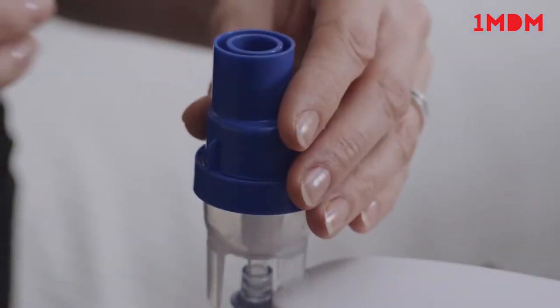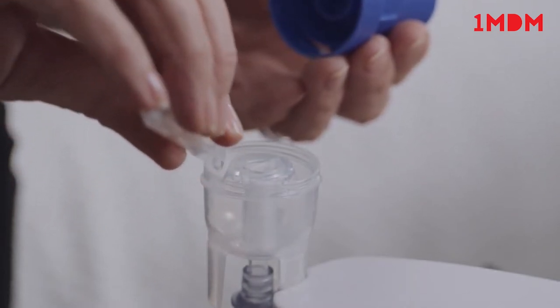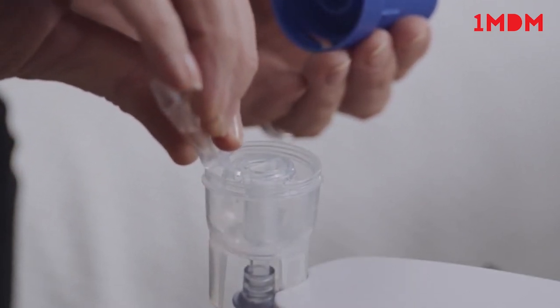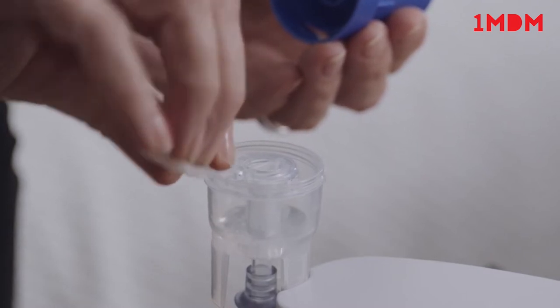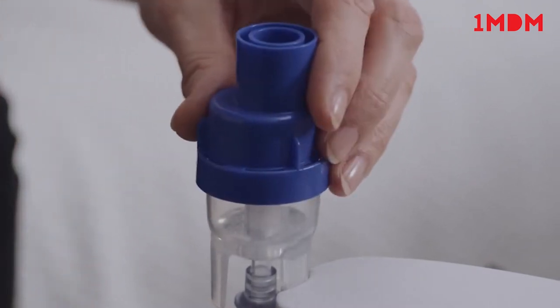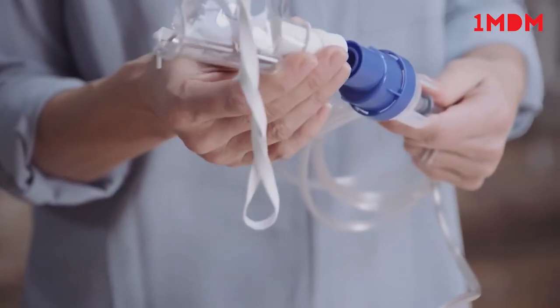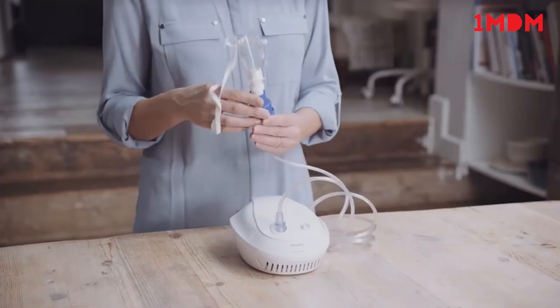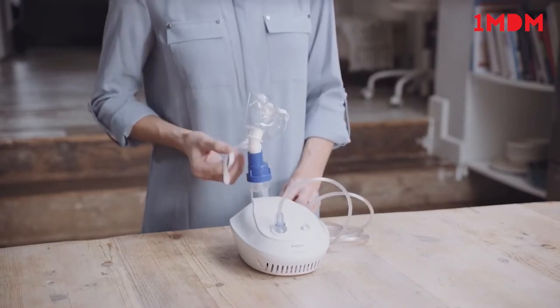When you're ready to add the medication, unscrew the top of the Sidestream Nebuliser cup and pour in the prescribed medication. The Sidestream Nebuliser cup is suitable for 2ml to 10ml doses. Screw the top back onto the Nebuliser cup and attach either the Nebuliser mouthpiece or the face mask.